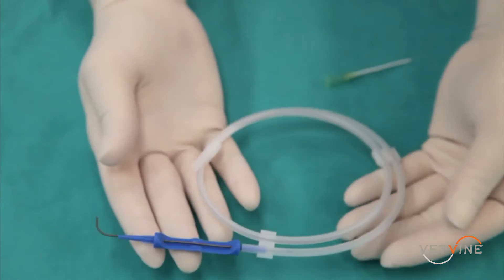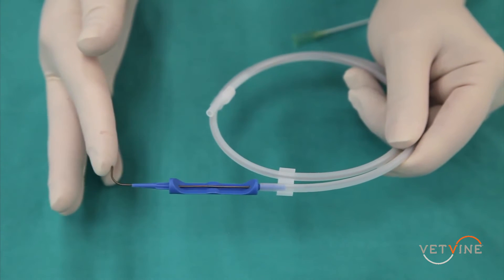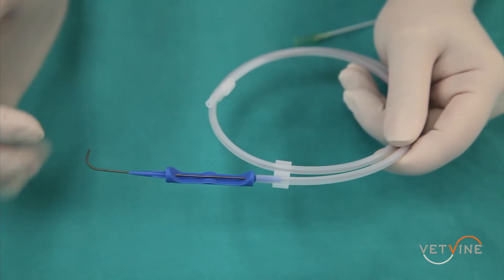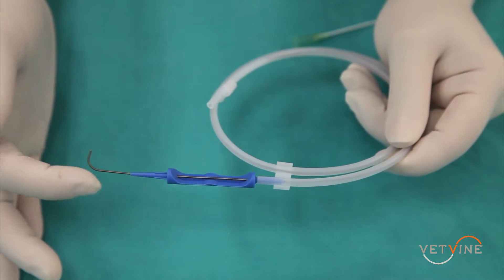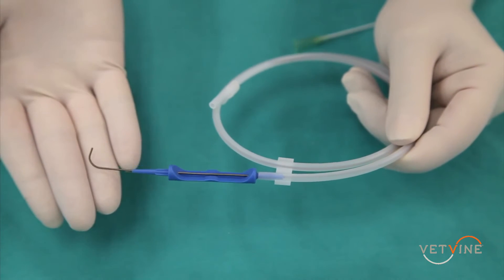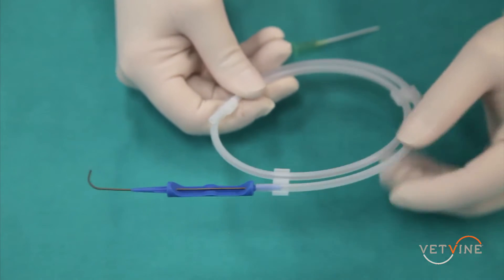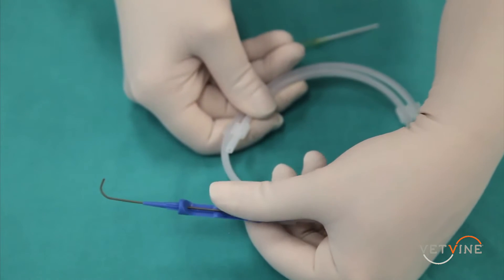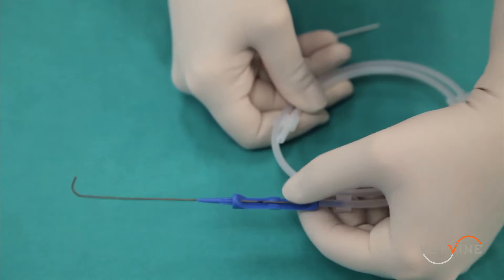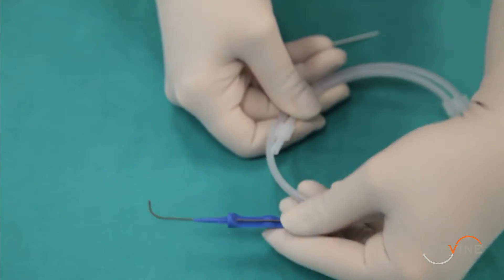It's important to note a couple of special features with the J wire. First, note that the J in the J wire is very soft, and once it's in the thoracic cavity, it will curve to prevent penetration of the lungs or any blood vessels. Secondly, there is a groove that helps facilitate pushing of the wire into the thorax through the needle.